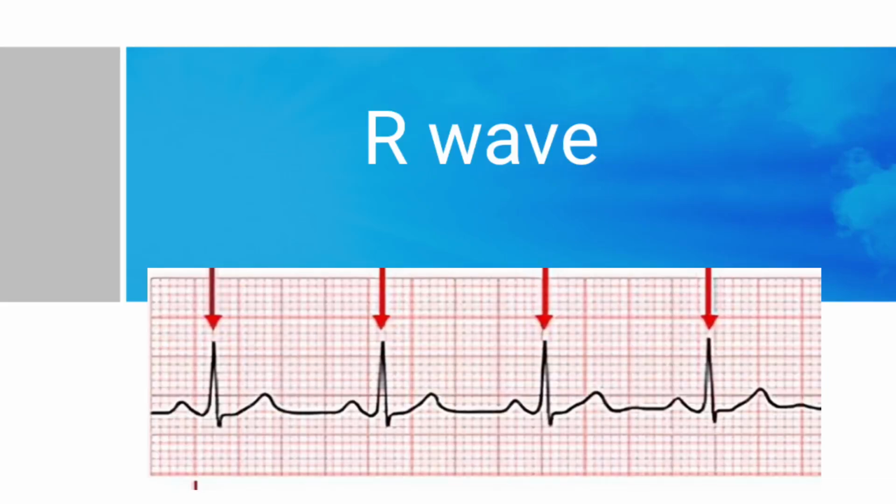In the series of ECG Basics, today I will talk about R wave.